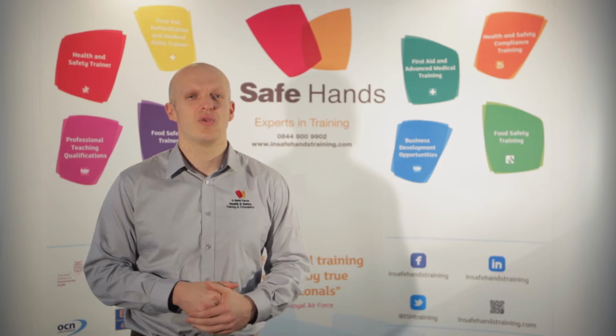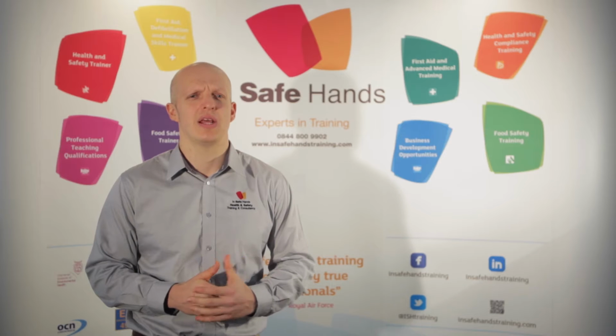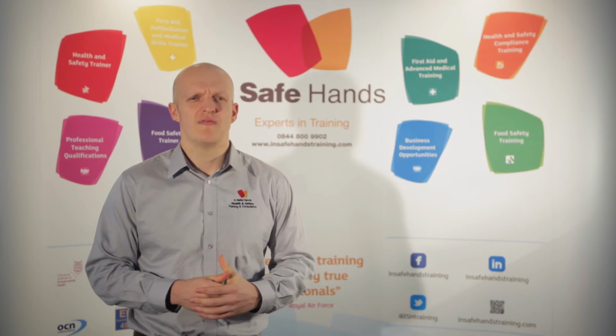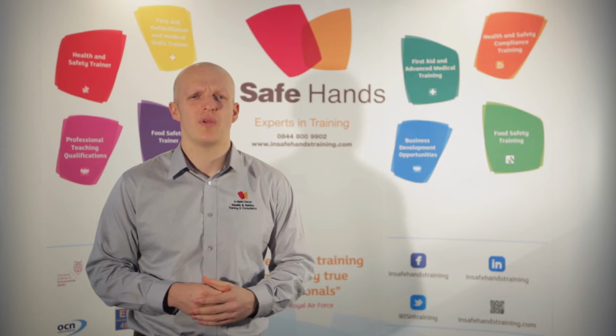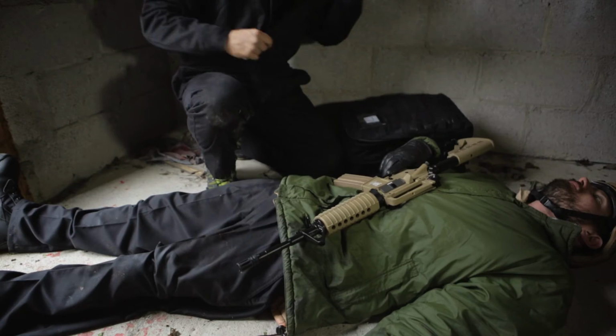Using the combat application tourniquet is extremely simple. It's been proven and effective to save many lives within war zones. Primarily it was designed for the person that injured themselves to actually apply it. Obviously, as a responder, we would like to apply that to our casualties.